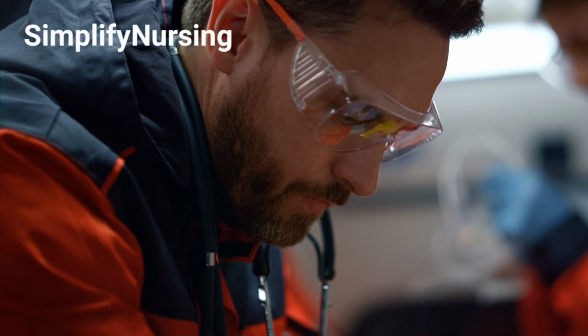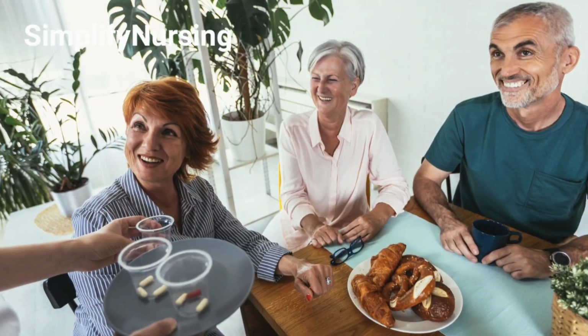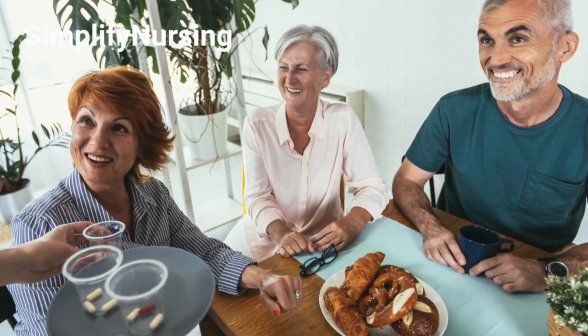Alright, let's move on to the procedure steps. Preparation involves getting informed consent, positioning the patient comfortably, usually supine, and administering pre-procedure meds like analgesics or sedatives.